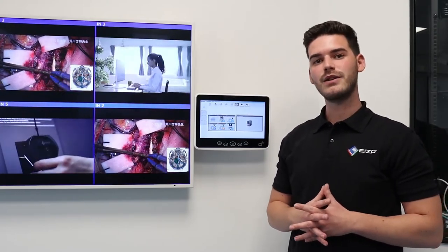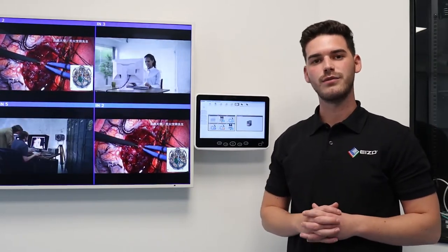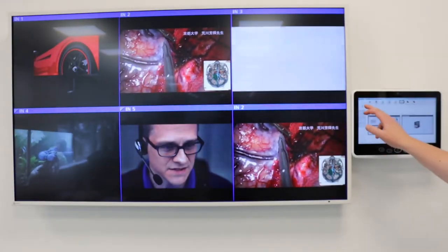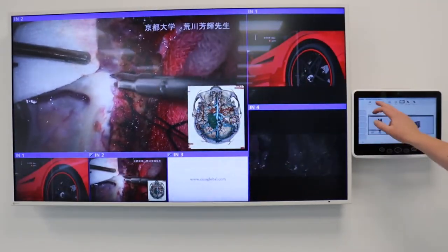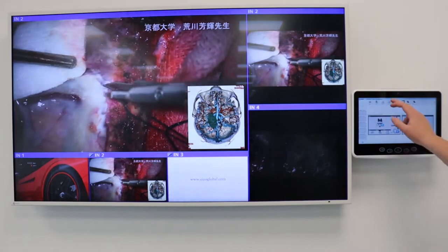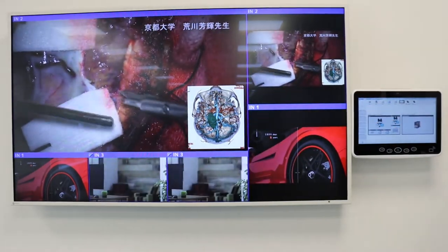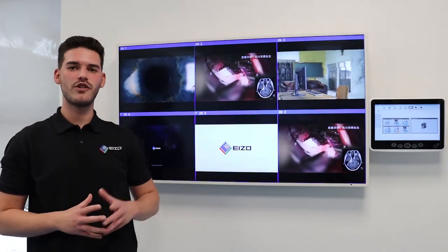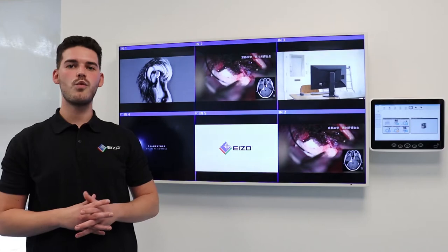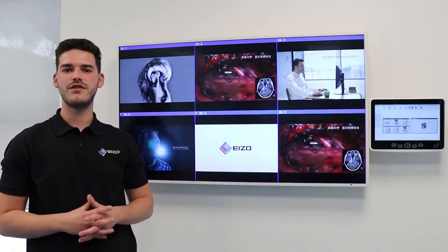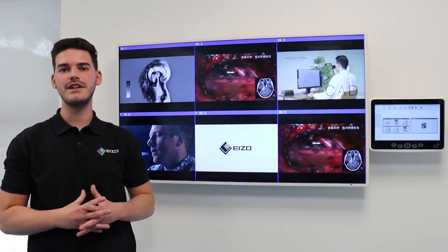It comes with a standard mounting of VESA 100x100 and can be mounted anywhere in the operating room. As you can see here, you can quickly and easily decide on different layouts for the output monitors using the predefined options on the left, and then have the ability to select which source from the top you wish to display. We're displaying this all on our LX491 here in white. This full HD DICOM widescreen monitor is ideally suited for viewing medical images such as x-ray, CR, MRI and endoscopy in the OR.